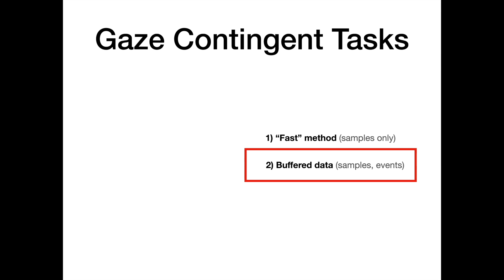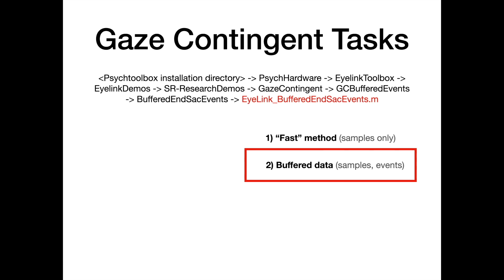To find the demo that shows how to use this function pair in the script, open the EyeLink-buffered-end-sac-events demo, found in the same gaze contingent folder, GC-buffered-events directory. This demo waits for the end of saccades made during each trial and retrieves the x and y gaze location at the end of each saccade, so a red dot can be drawn on the screen at the saccade landing position.